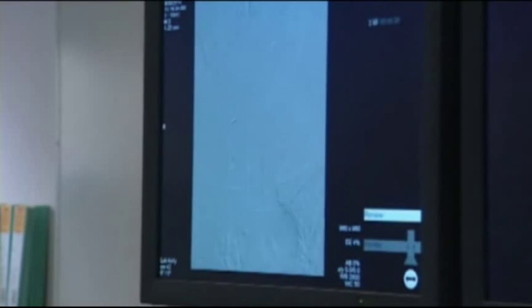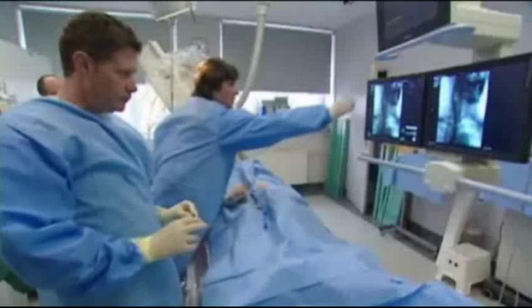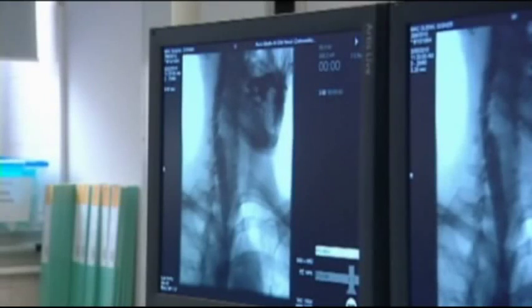The technique is borrowed from routine surgery to open blocked arteries. So we'd like to check in the right jugular vein. Here we can see the outflow goes quite smoothly through the valve, and this one as well. But it's bad news for Ginger. There doesn't seem to be a big problem in her right jugular vein. Maybe it's not necessary to put the stents here.